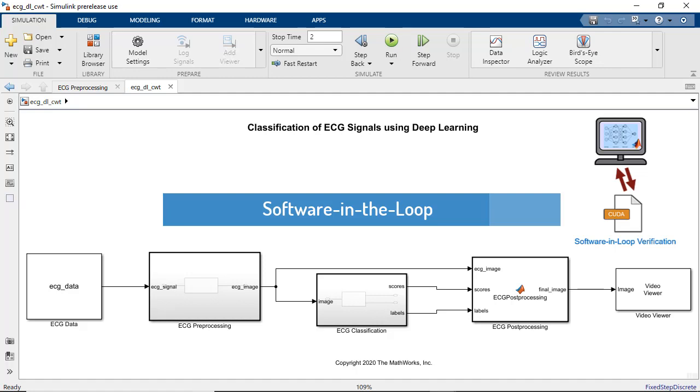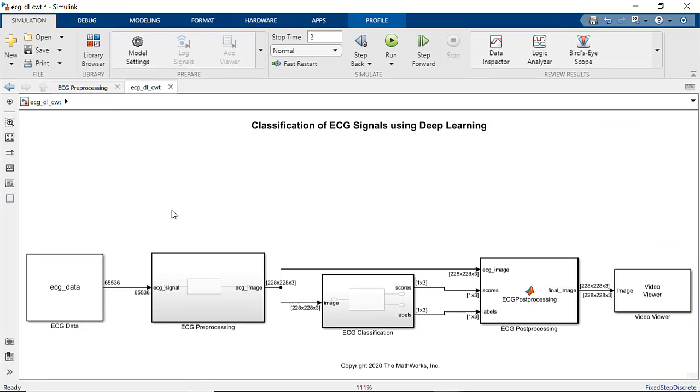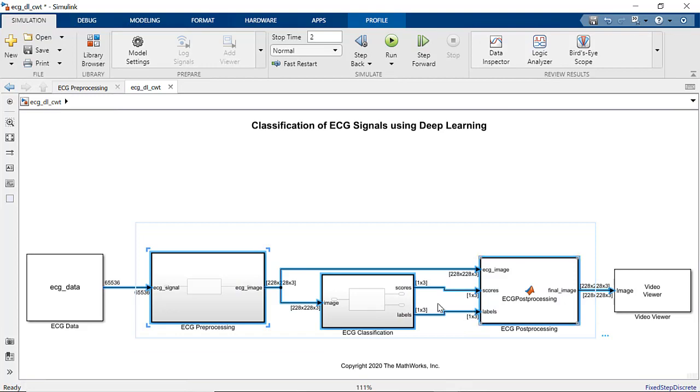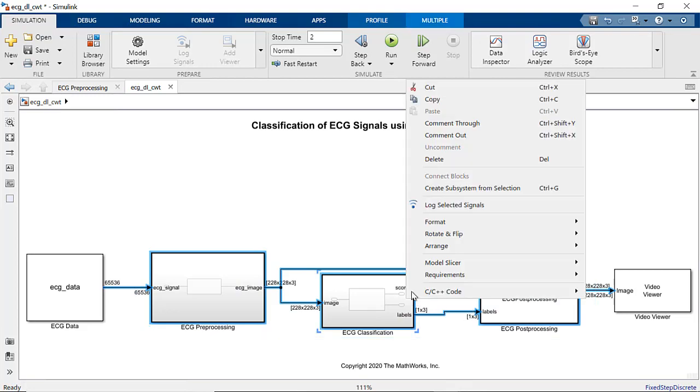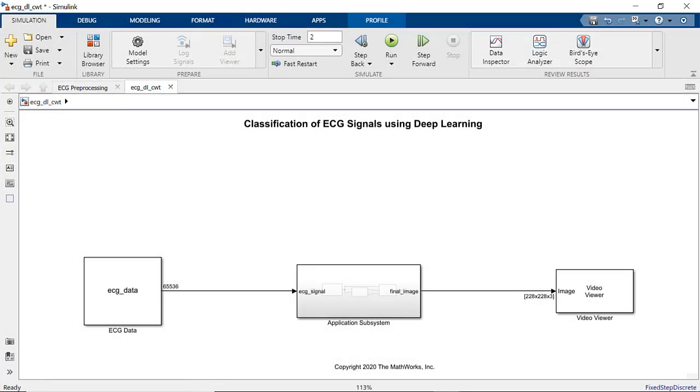To do this, we will run software in the loop testing. Let's first group pre-processing, pre-trained deep learning network and post-processing parts into a single subsystem. This will make running SIL easier.